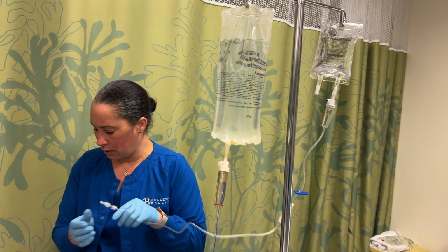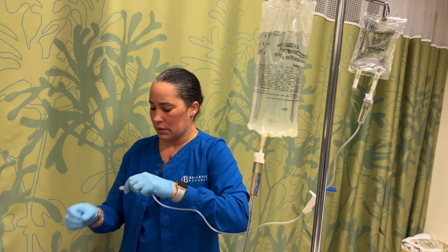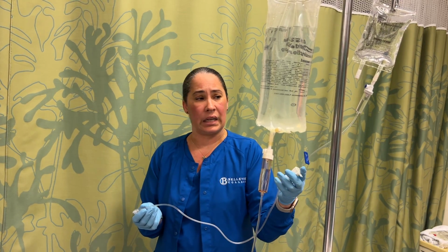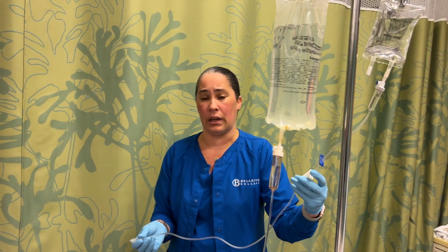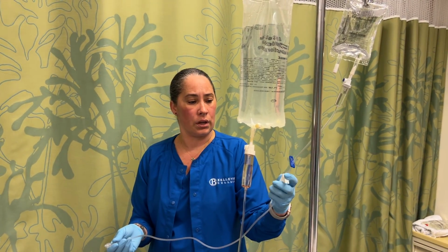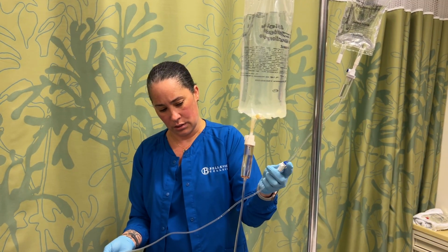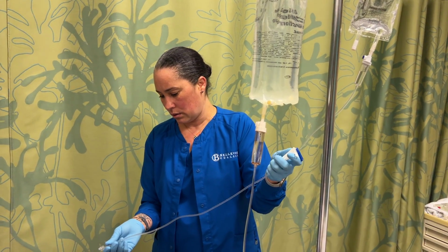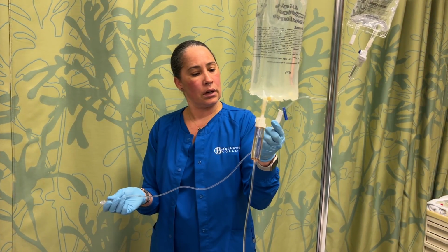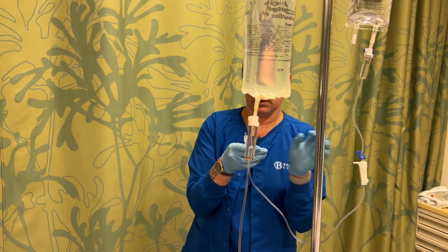Perfect. And then same as the last, you're going to just go ahead and let some of it flow out into the trash. With this one, because it's a medication, you're going to be careful and not just let it run. So just as soon as the bubbles are gone, just shut it off. Okay, so we are going to prime our tubing. Okay, bubbles are out. All right, so we're locked. I'm going to clamp this too.